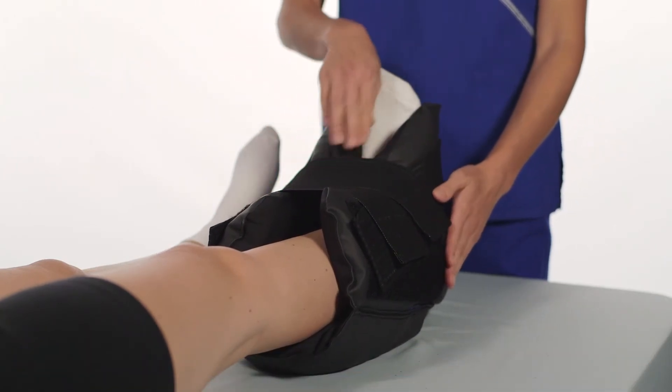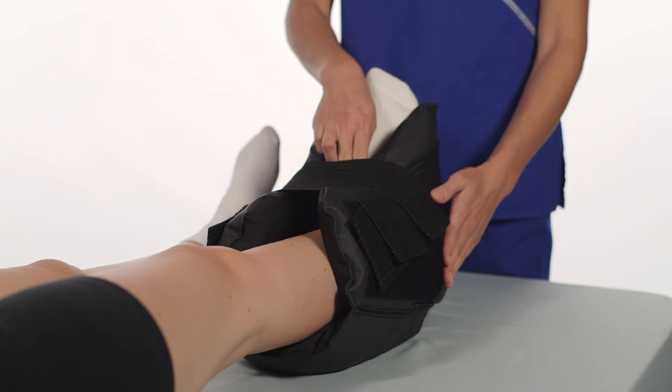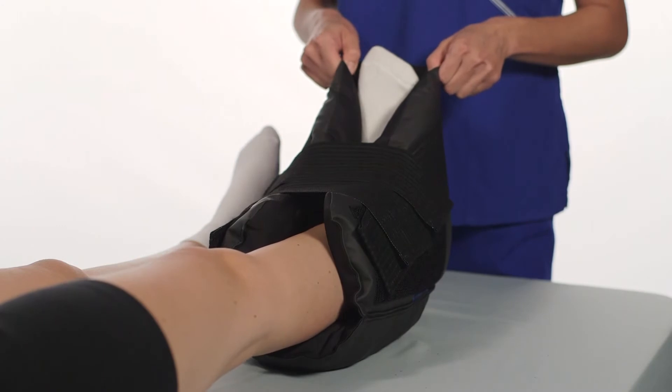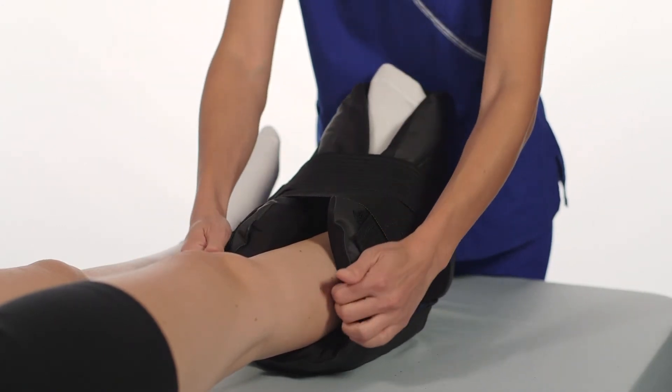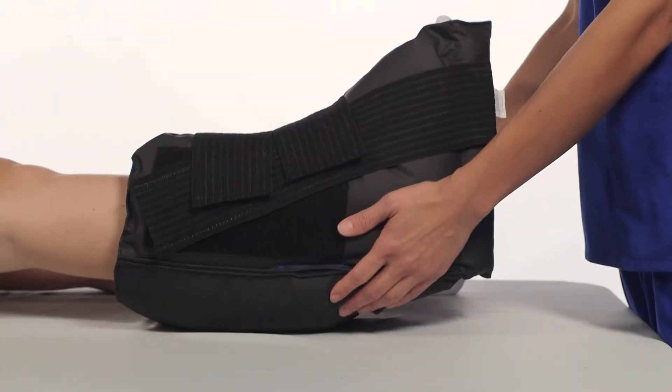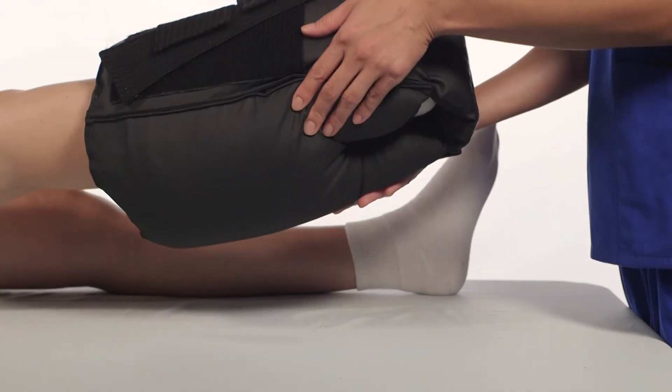Make sure two fingers fit between the device and the patient to ensure circulation is not compromised. Pull both foot flaps up and side flaps toward the patient to ensure that the device is secure and that the heel is suspended over the heel opening.